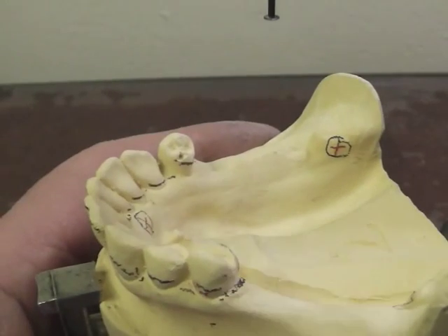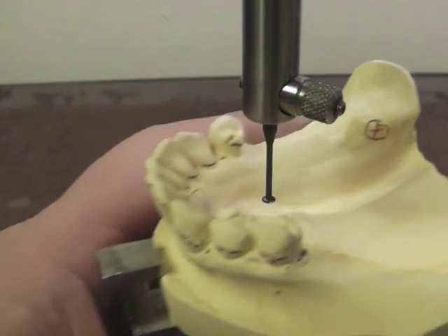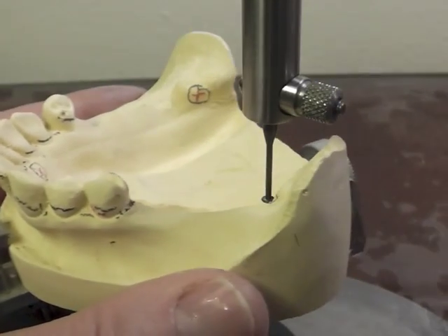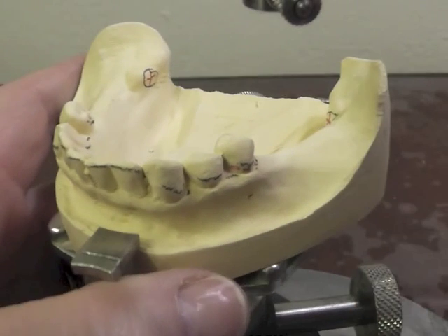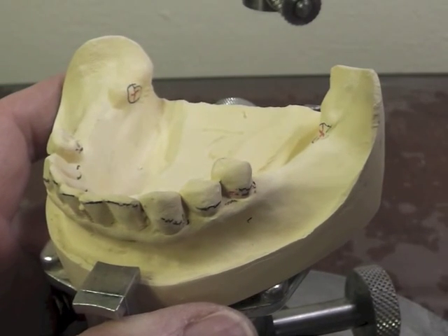When the lab technician gets the cast, he will line it up to where he can have that touching in those three locations. We cannot move this up and down — we're basically ready to decide our design and place it on a piece of paper.